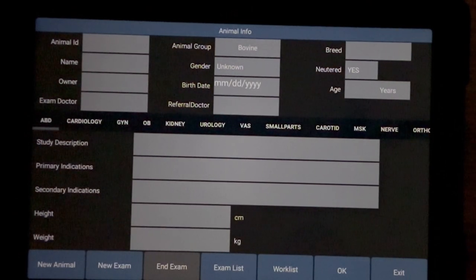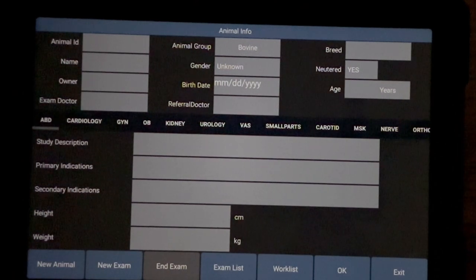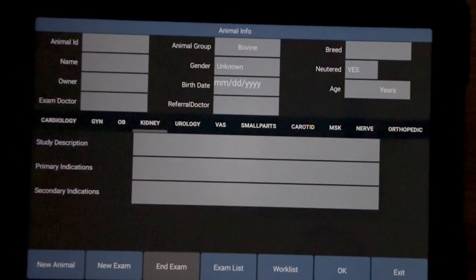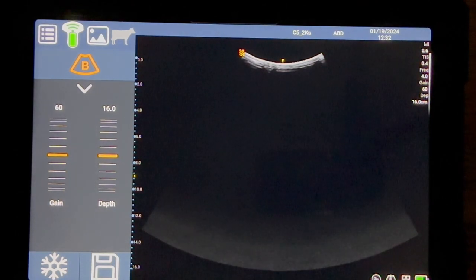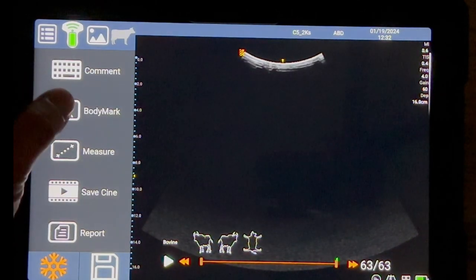When you've done a scan and you'd like to complete the information about the animal, you can do that here. If you're not doing cattle you can choose a different animal group. Along here you have different examinations. If you're carrying out a scan and want to freeze a frame and fill out information, simply press the freeze option. On the left-hand side you have your comments, body mark, measure, save your cine — which saves your video clip — and then report. The body mark is for marking where the calf is and saving a shot of that.